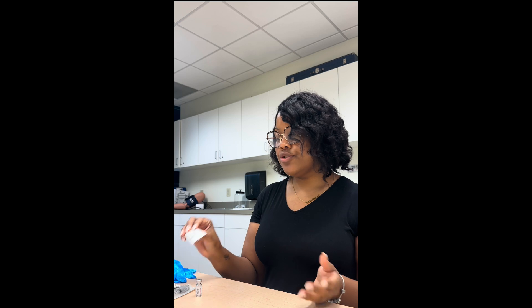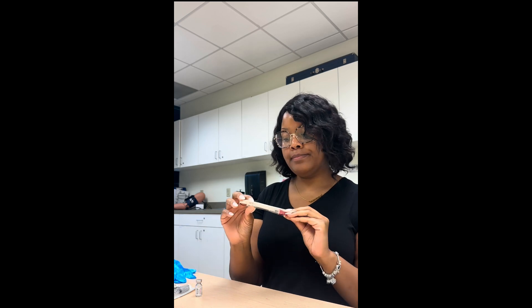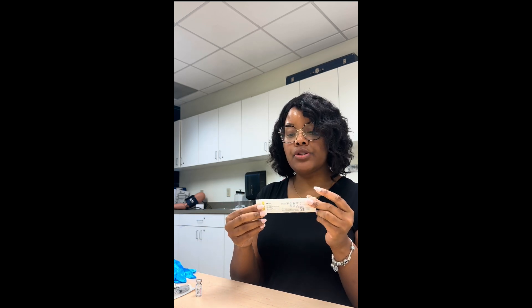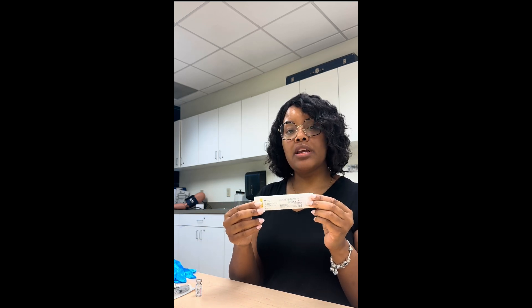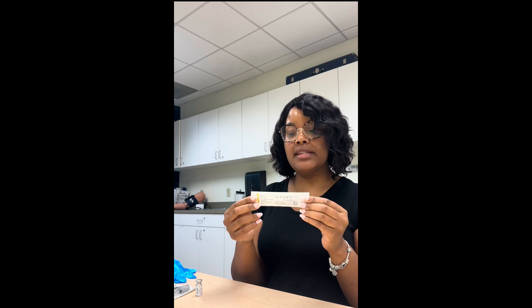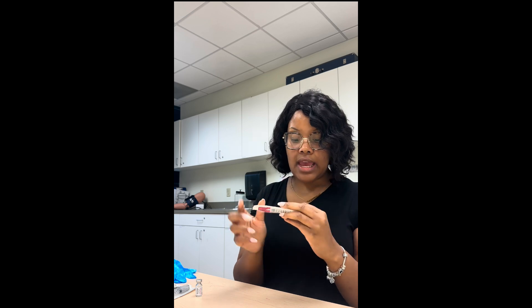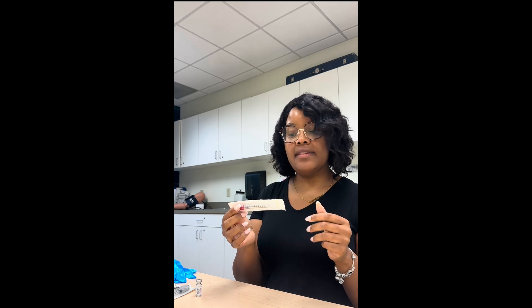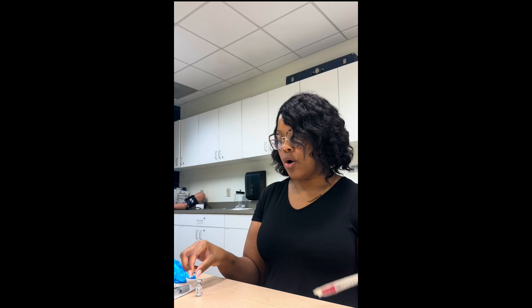Hello everyone. Today we will be doing intradermal injections. So what do you need? You need your TB syringe. We actually have a syringe that says TB — it is a 25 gauge and 5/8 inch in length.